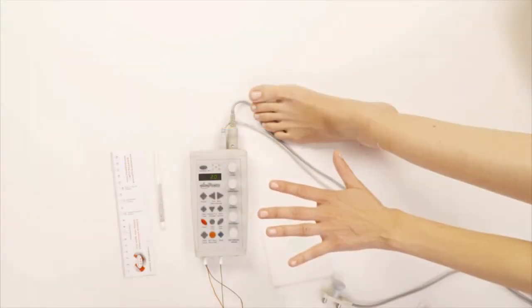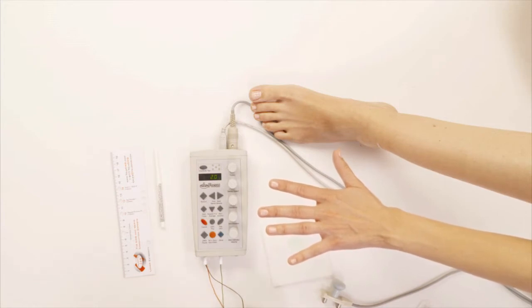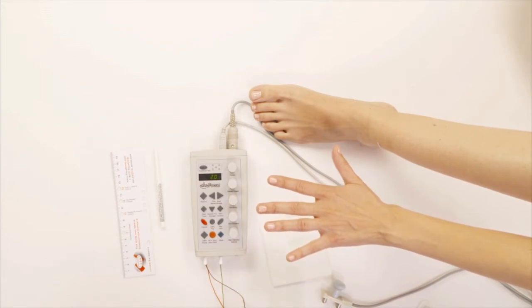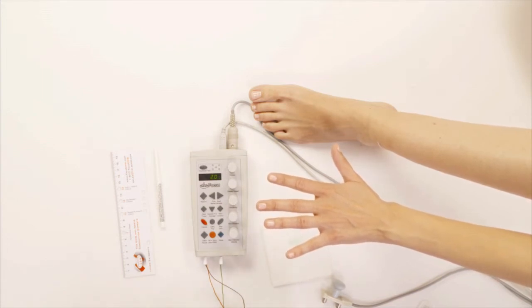So now we're going to do the galvanic skin response, and the galvanic skin response is actually very useful for small fiber neuropathies. These are neuropathies that give you pain and burning in the feet.